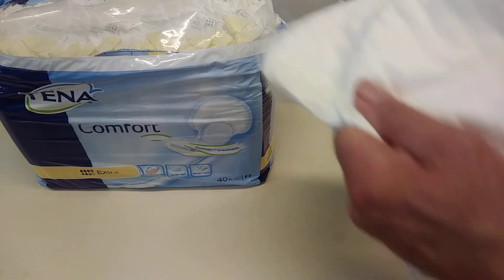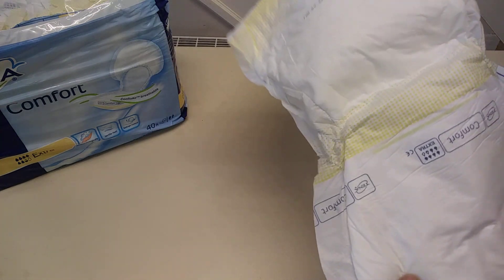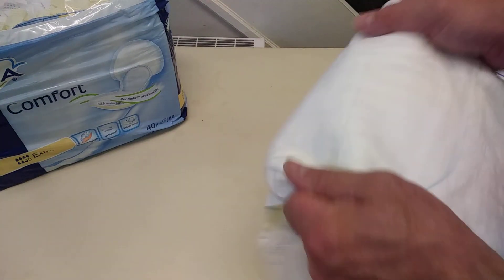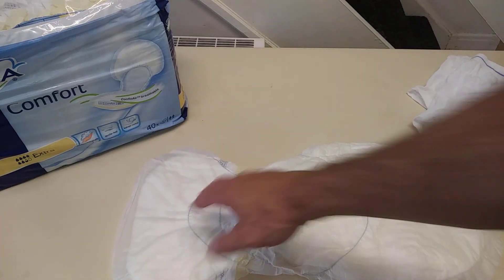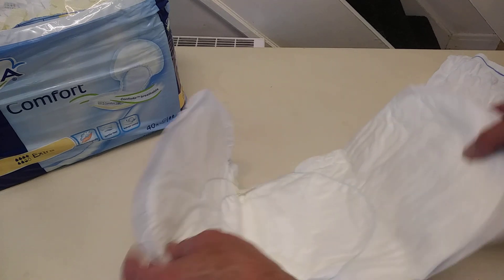The big bit goes at the back and the small bit at the front. You can see how really strong that is, and at the back you've got — there are full instructions. I was always told by the incontinence nurse to give it a pull like that, and then that takes any leakage from there.